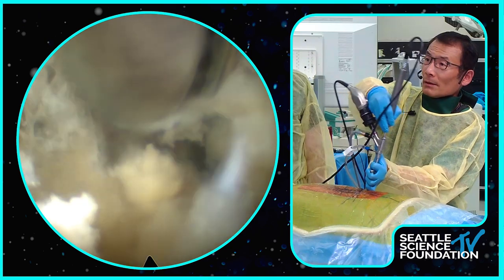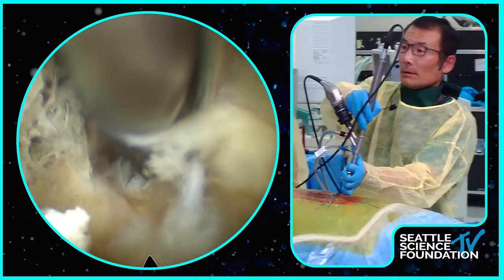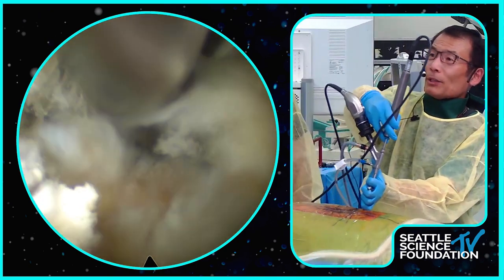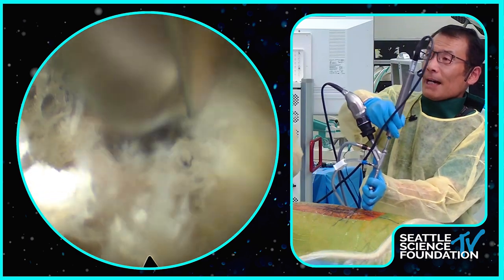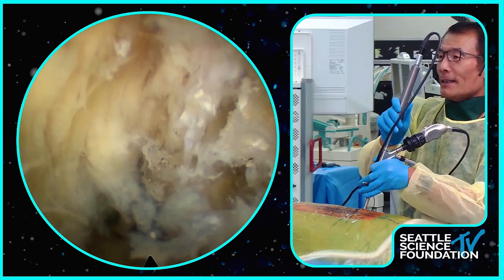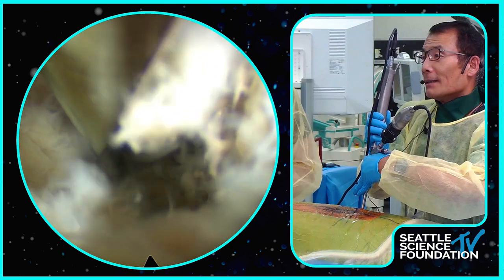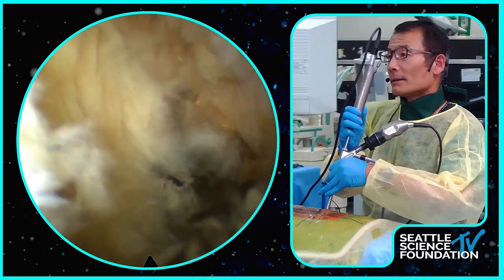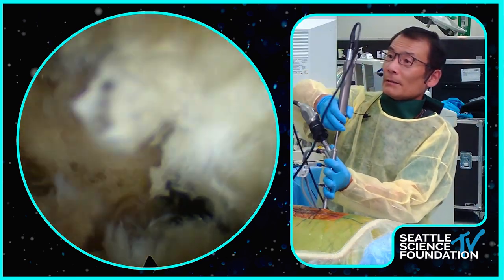Do you have a preference about how much of the pedicle you want to see, like the L5 pedicle? Do you want to drill? I would like to see the medial wall of the pedicle, definitely. Sometimes, if you do more drilling laterally, you can see the, now I'm looking laterally. Let me show you the pedicle.